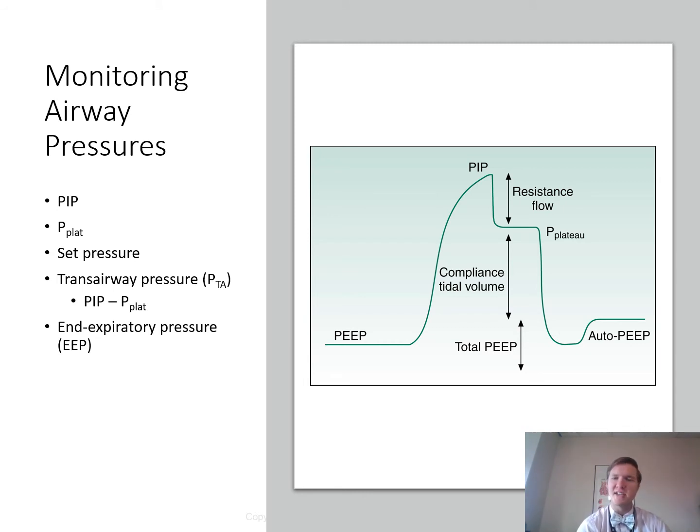But when we're looking at this, this is an airway pressure waveform. And this is just an example of an airway pressure waveform used during volume-controlled ventilation. At end inspiratory, a breath hold is applied, and then we can also do one at end expiratory hold, right? So we want to do an end inspiratory breath hold, which is called an inspiratory pause maneuver, as well as an end expiratory hold. And what we're looking at here is, when we do these maneuvers, plateau pressure for end inspiratory, and then at end expiratory, auto PEEP, right? We're going to look at how much auto PEEP there is. So here, there's a difference between our PIP here.